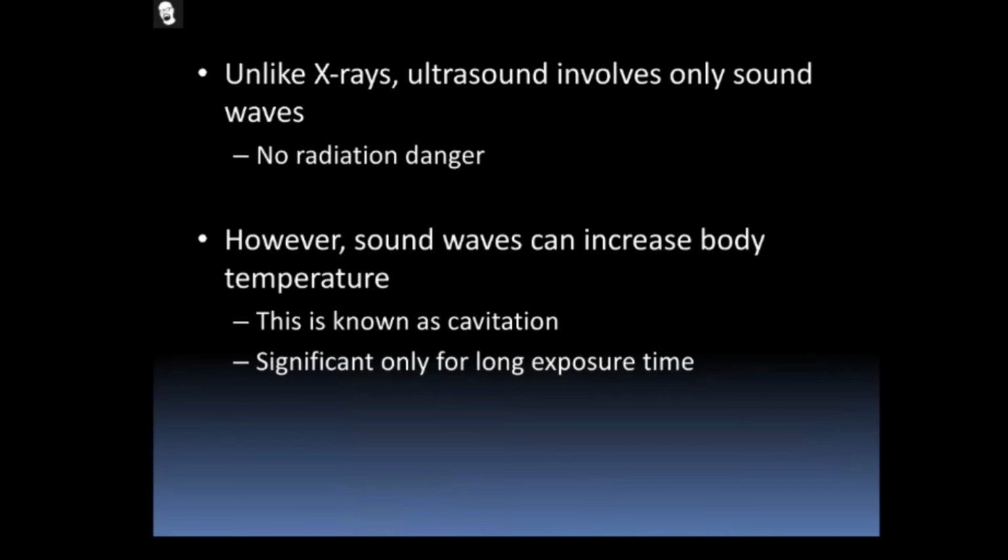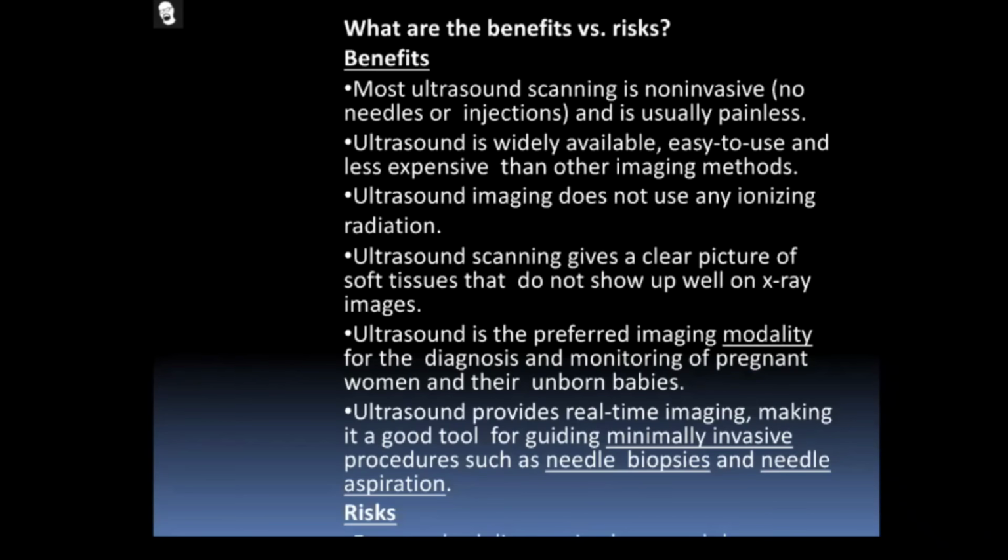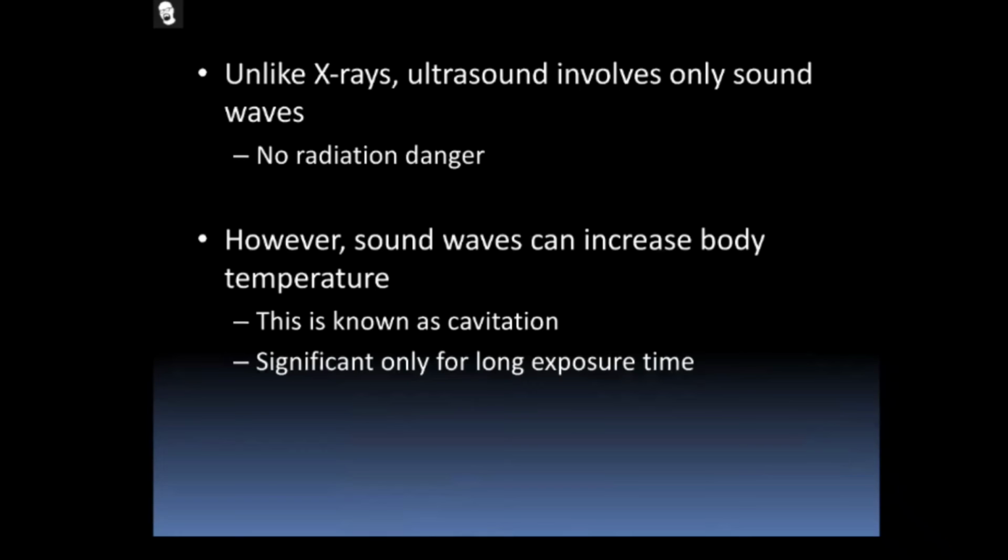Unlike X-ray, ultrasound involves only sound waves. No radiation danger is there. No secondary radiation, and no primary radiation either. Only sound waves, and that sound wave does not give any ill effects to the internal organs. That is what the doctors are suggesting.